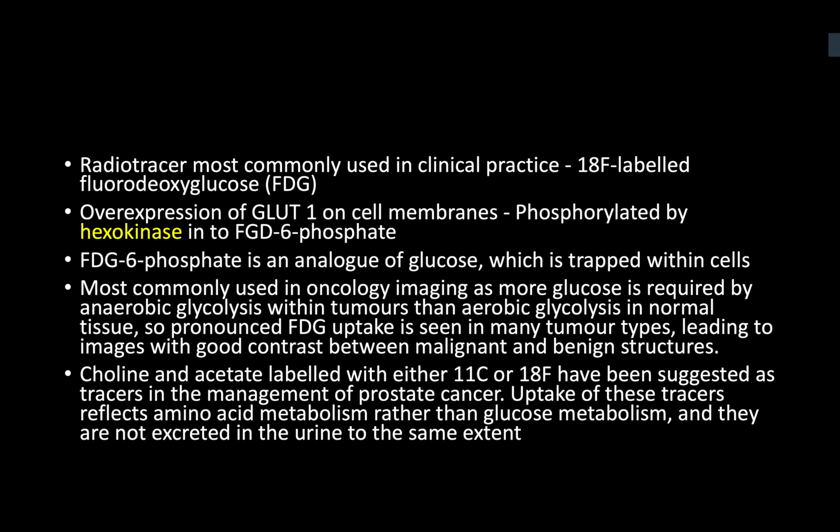So that's why the PET scanner can image it, lighting up in metabolically abnormal areas. There are other options for prostate cancer, we'll come to that later, choline and acetate. But choline and acetate are mainly based on lipid and amino acid metabolism rather than glucose metabolism.